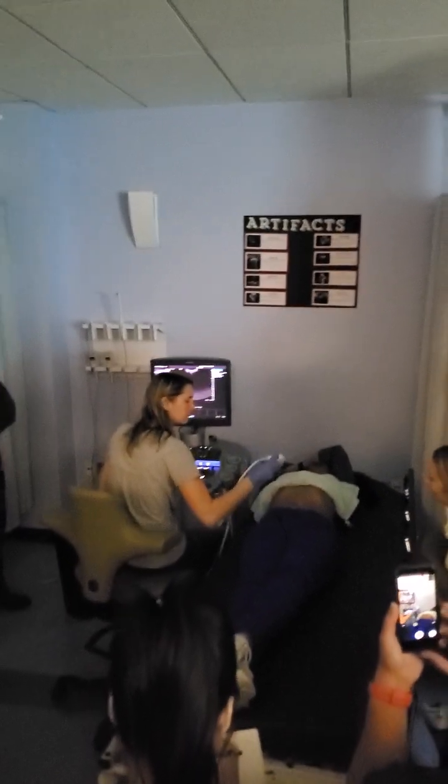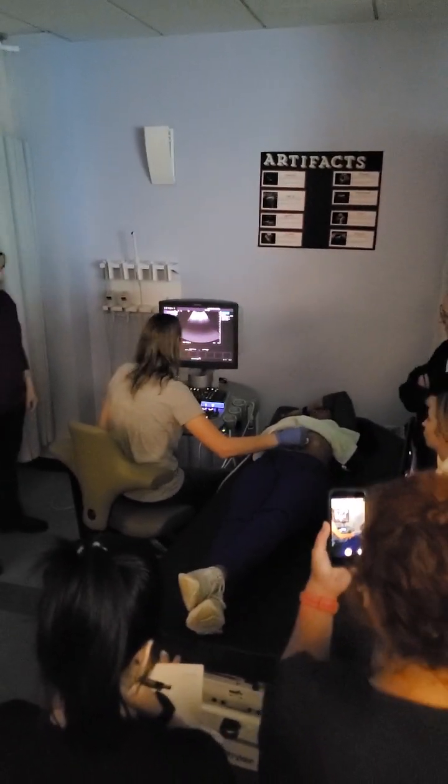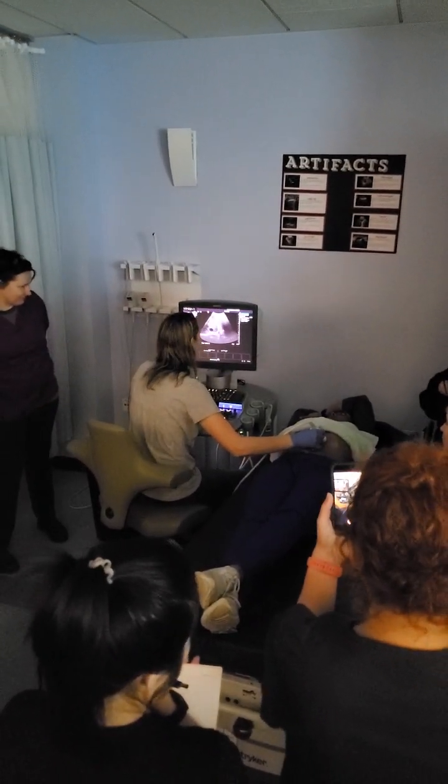Alright, so alright, go ahead and big breath in. It's just that it's not.